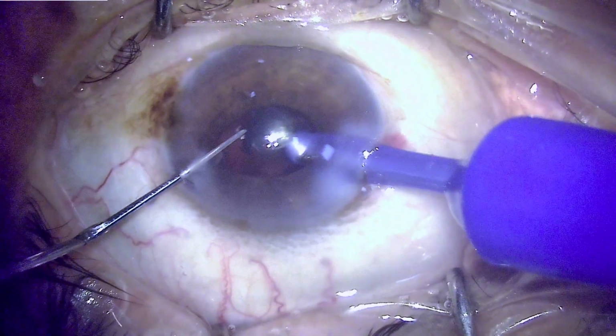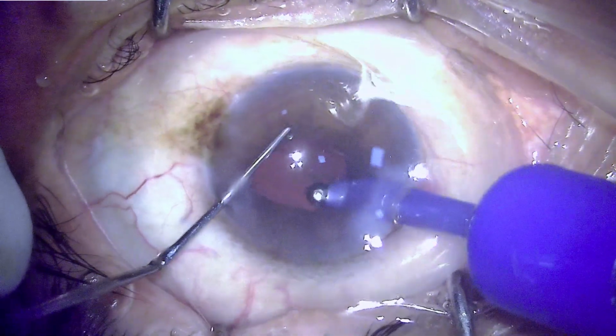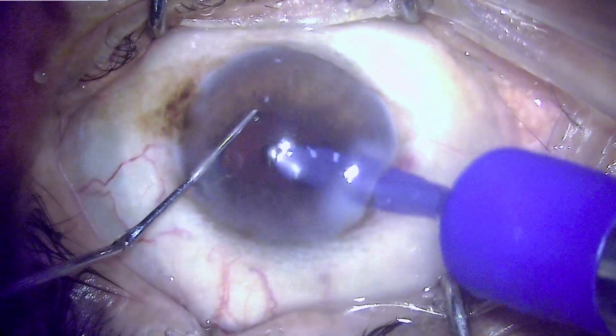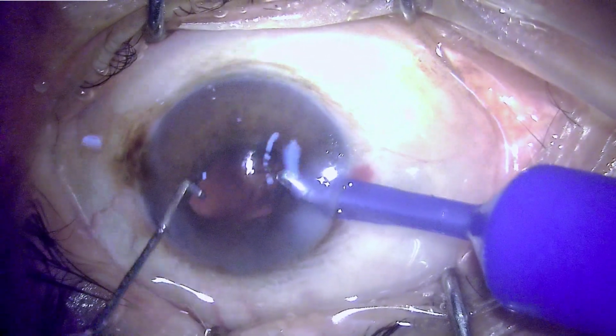Once the cortex has been removed, we can also keep an eye on the surface of the posterior capsule, which can be harboring a few fibers, and we can polish it just using the irrigation aspiration tip.